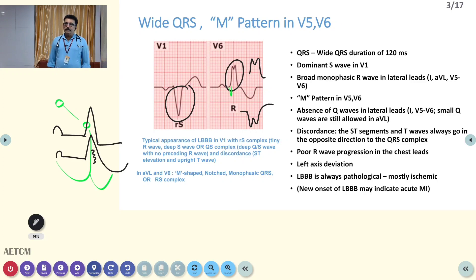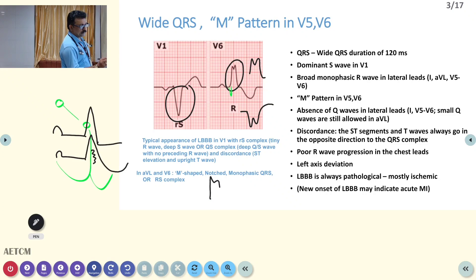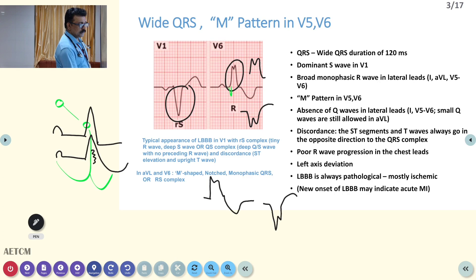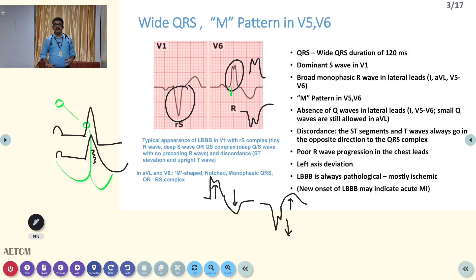Discordance of the ST segment is a very classical sign, and it is the major predictive change in acute myocardial infarction. Discordance means: if you have an M pattern in LBBB where the QRS is up, the ST segment and T wave will be down or negative. Whereas if you get a W pattern in the QRS complex, the ST segment will be upwards. In normal LBBB this discordance pattern is classical, but in myocardial infarction it will be concordant.